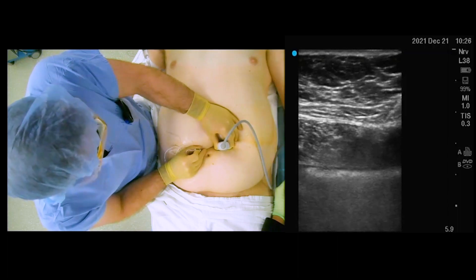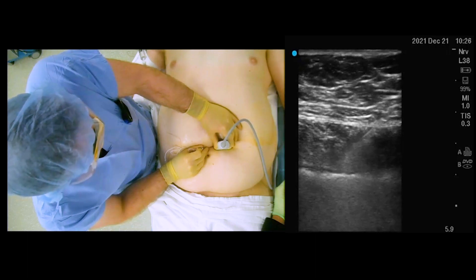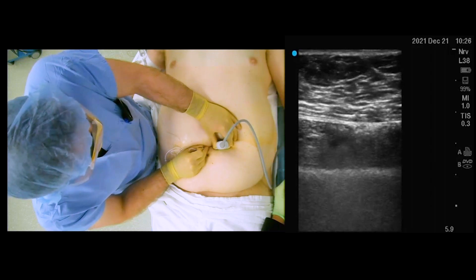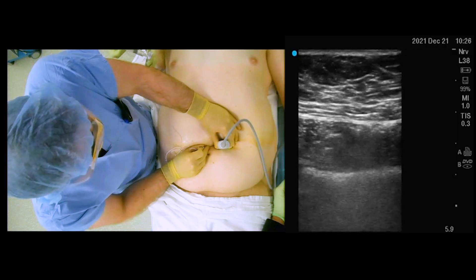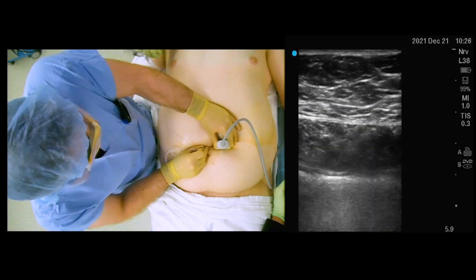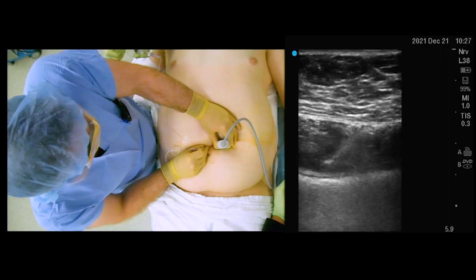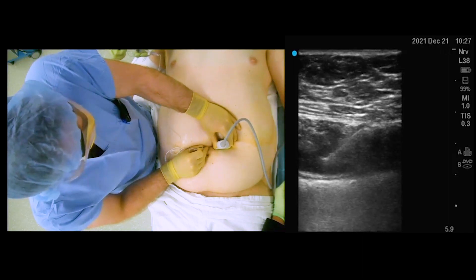Again, the needle was advanced in-plane through the rectus muscle, just before exiting the fascial plane on the opposite side. Once an appropriate position was obtained with constant visualization of the needle, brief hydrodissection was performed with normal saline, followed by administration of local anesthetic.